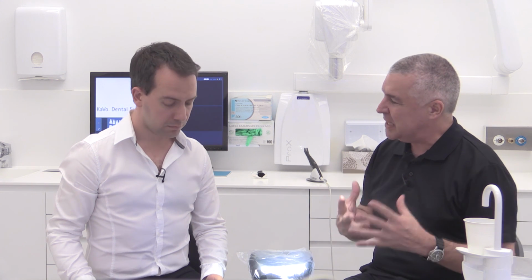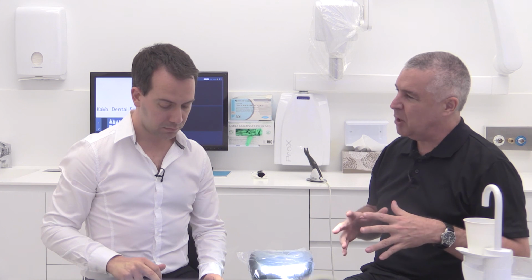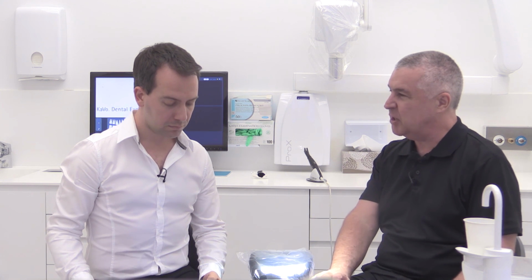So I'd encourage people who are using it to really try to get the best out of it and spend some time looking carefully at all the tooth colour restorations and sealants that you find, and don't just limit it to looking at interdental lesions, because I think that would be a bit of a mistake.